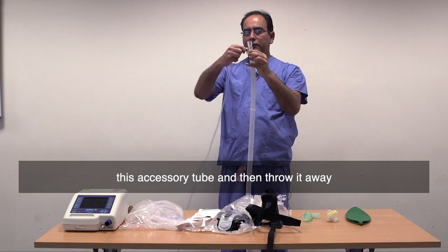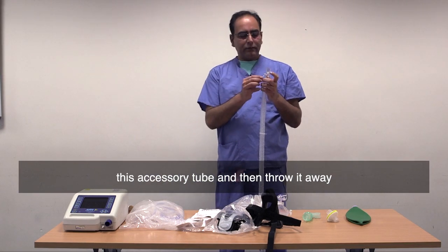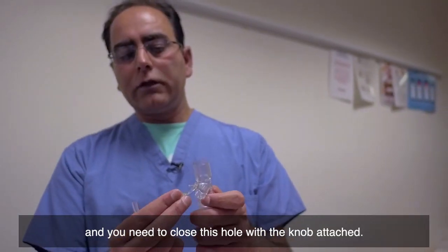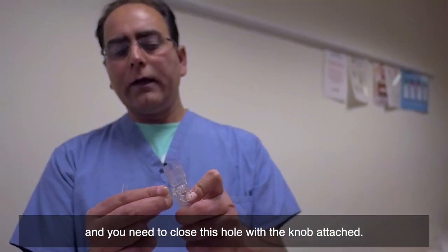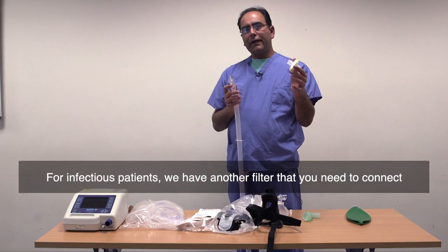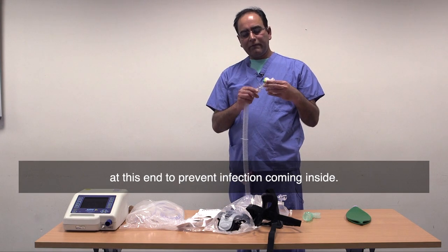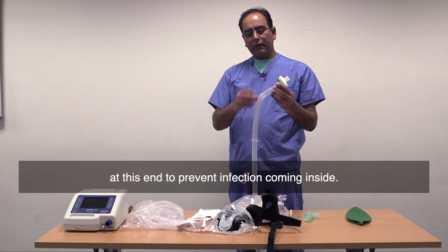You have to detach this accessory tube, then throw it away, and you need to close this hole with the knob attached. For an infectious patient, we have another filter that you need to connect at this end to prevent infection coming inside.